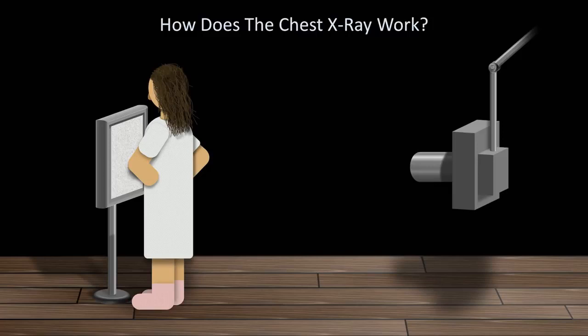Now we have our source, our detector, and our patient, so we'll turn on the X-ray for a very brief, predetermined length of time, and X-rays, that is high energy photons, will shoot out of the source.